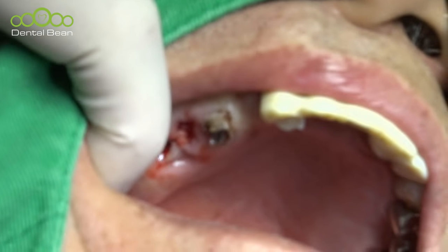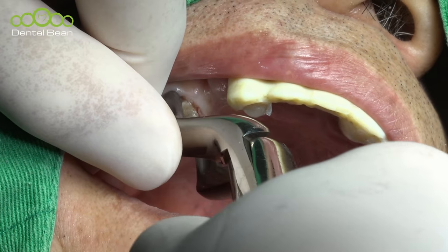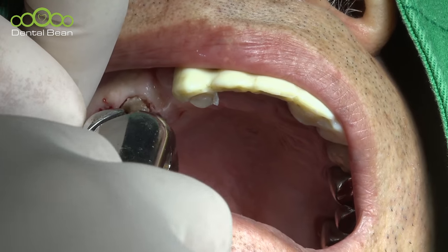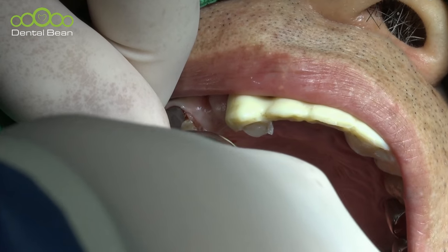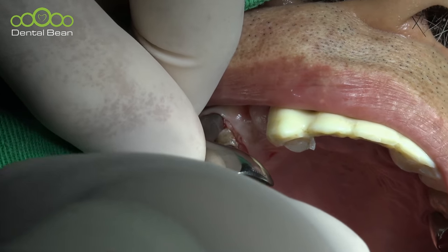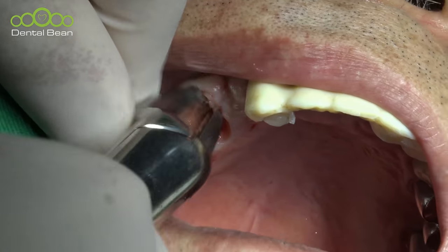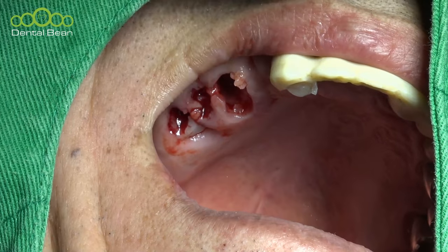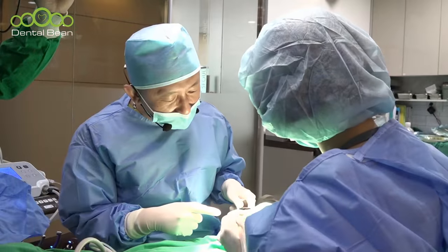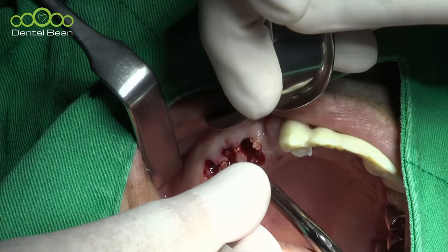Forceps. Okay. I will say, open wide. This is my favorite retractor, the Langenbeck retractor. Okay, incision design, first one, the crestal incision.